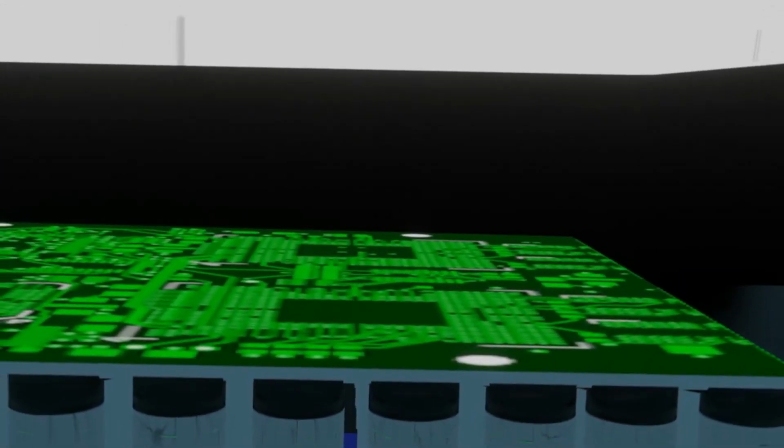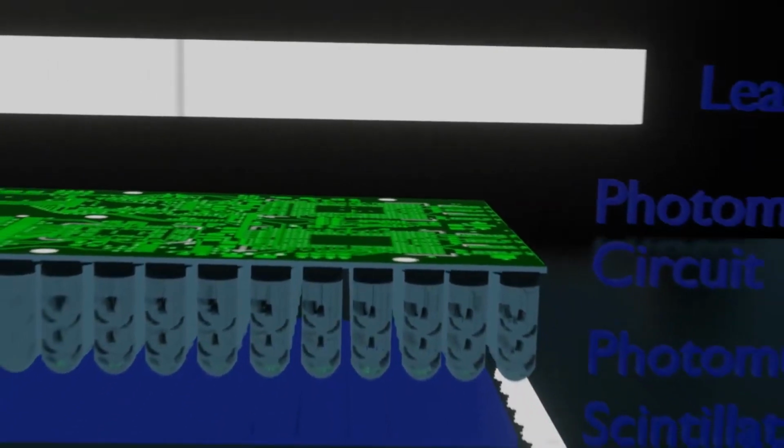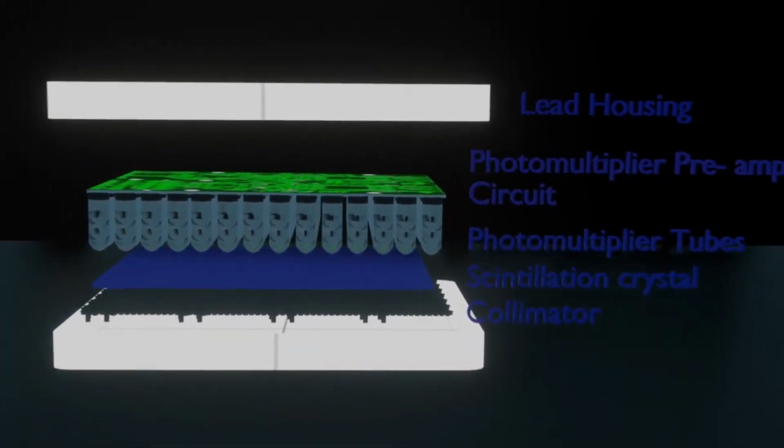Detector system and electronics. The gamma camera employs a single large area rectangular NaI detector crystal, usually 6 to 12.5 millimeters thick with sizes of up to 60 by 40 centimeters. An array of PM tubes is coupled optically to the back face of the crystal with a silicone-based adhesive or grease. Round PM tubes are arranged in a hexagonal pattern to maximize the area of the crystal that is covered. Some cameras use hexagonal cross-section PM tubes for better coverage of the crystal.